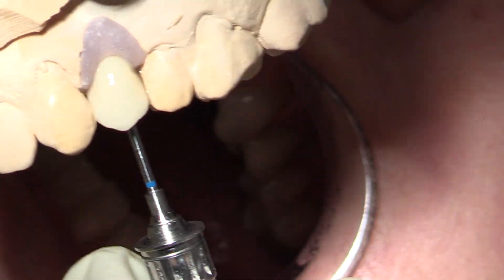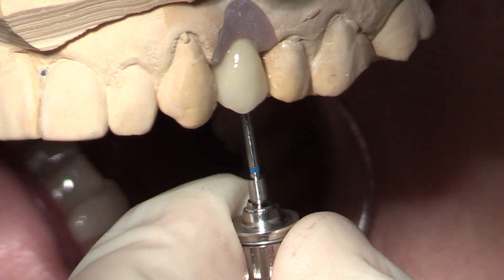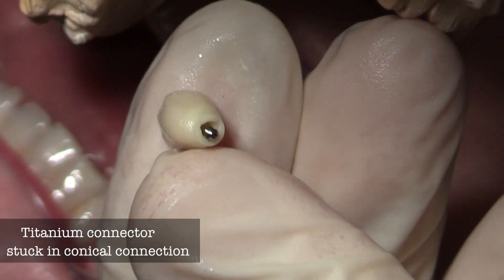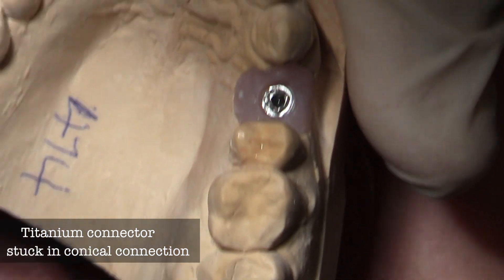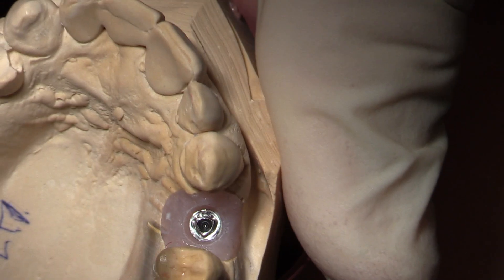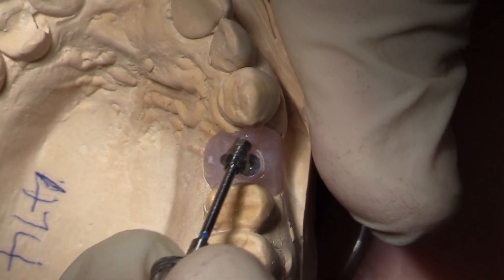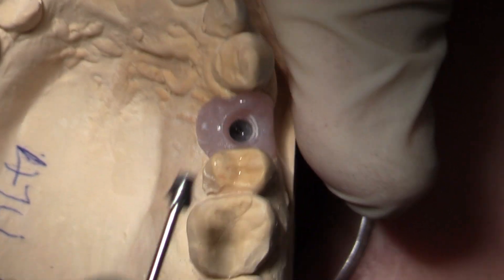We'll place the OmniGrip driver — watch how it articulates. It actually snaps in place because of the design of the end of the screwdriver and the screw; the two get articulated quite nicely. When you take it off, sometimes the metal connector is going to stay stuck in the conical connection, because this is a precise fit. To get it off, just take your OmniGrip screwdriver, rotate it twice side to side, and the metal connector will pop right off the implant. You can also just leave it there since it's hexed and a very precise fit.